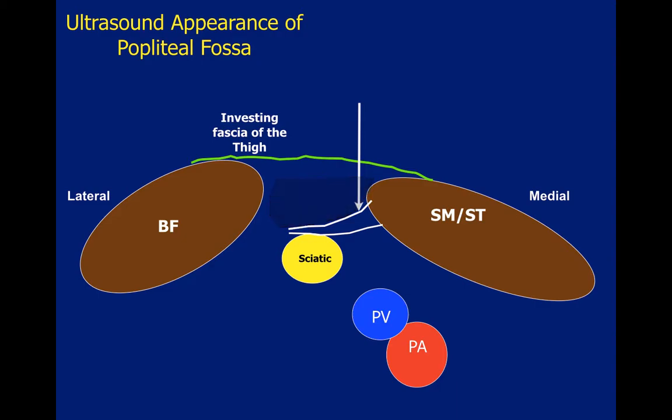It is also important that the needle tip not be positioned within the investing fascia of the semimembranosus semitendinosus muscle, since the investing fascia will retain the injectate within that muscle and not allow distribution to the nerve. Although these examples show out-of-plane approaches, an in-plane approach is also possible. Here we see the injection within the investing fascia of the semimembranosus semitendinosus muscle contained within that muscle.